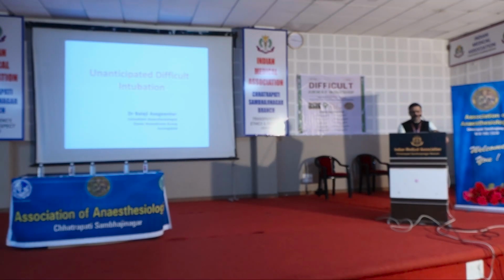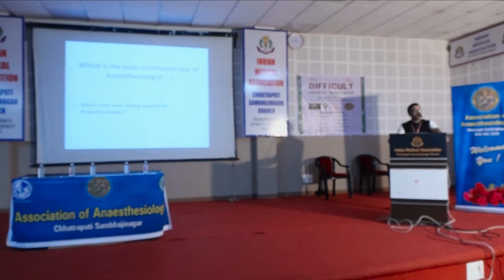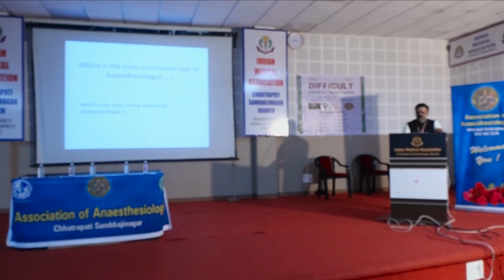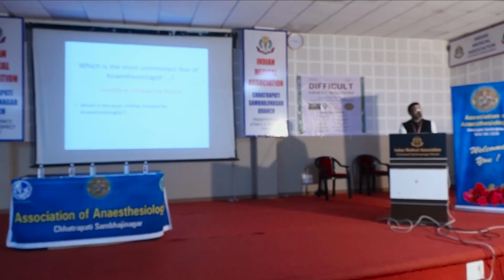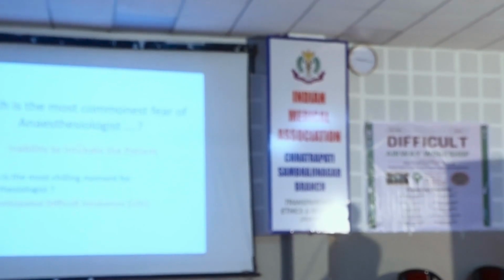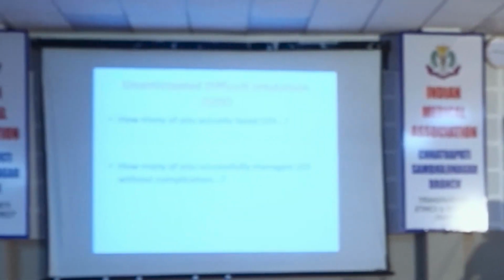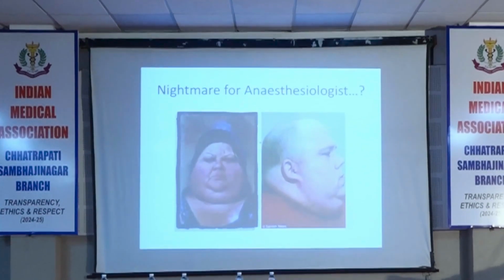Unanticipated difficult intubation. Now, what is the most common fear you face as an anesthesiologist when you are doing a case? That is the inability to intubate that patient, and most of all the unanticipated difficult one, where you are not prepared and suddenly you are unable to intubate. Now, is this a nightmare for an anesthesiologist?